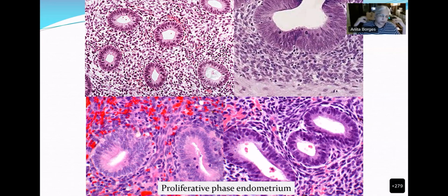Oh, you can do lots of other things. You can go and do immunohistochemistry, and you can look for proliferation markers, labeling indices, etc. But most of the time, what are we dealing with? We are dealing with an H&E section. And the only way that we will know that something is proliferating is if we look for mitosis.